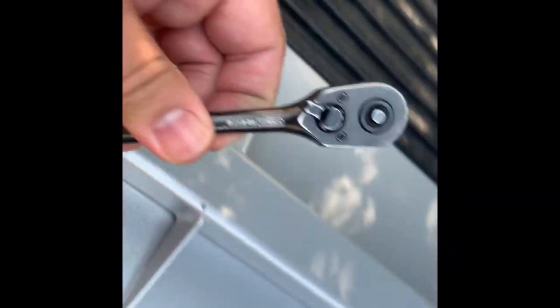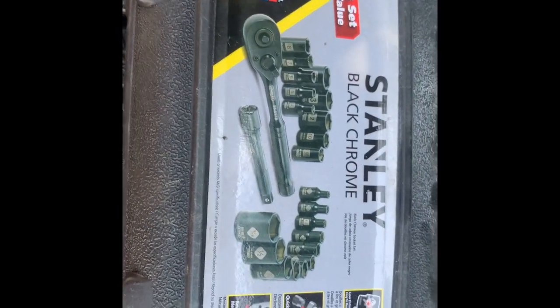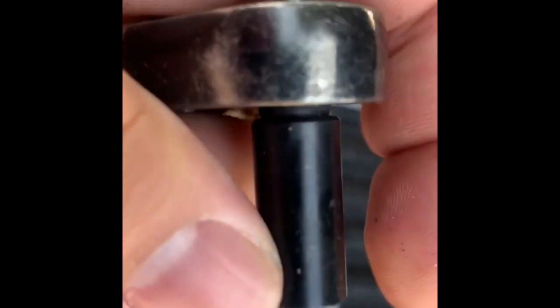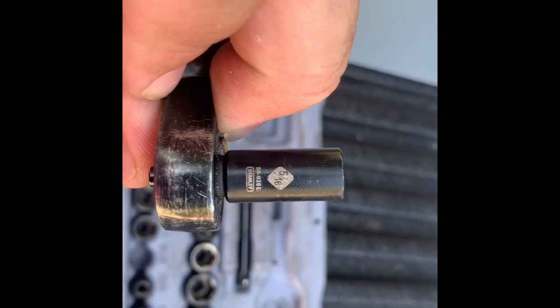You're going to want to use one of these — I have a whole set here. What you want to do is use these quarter-inch drives, specifically a 5/16ths socket. It's going to make it a lot easier to hook up these nuts and bolts.